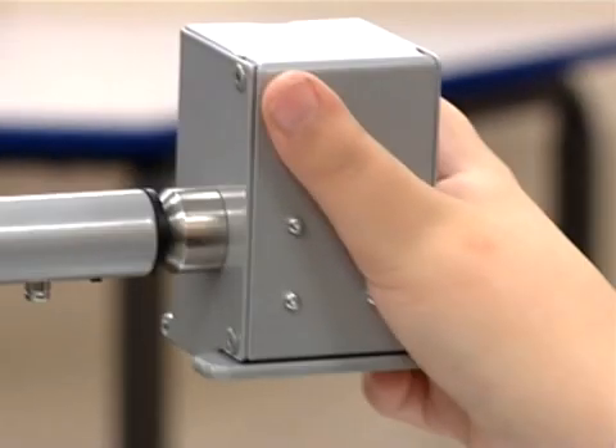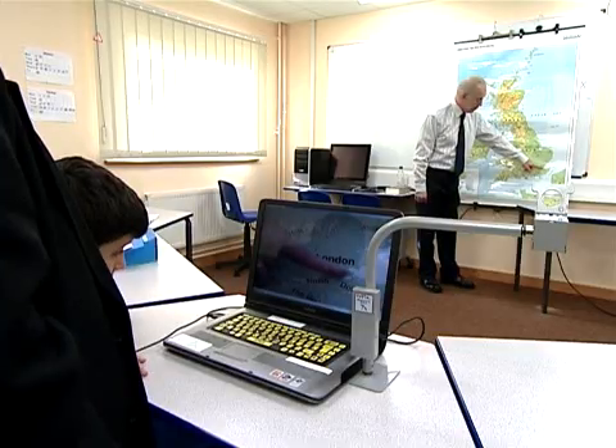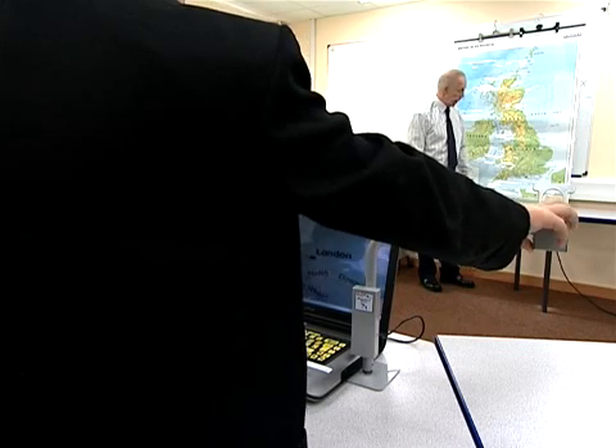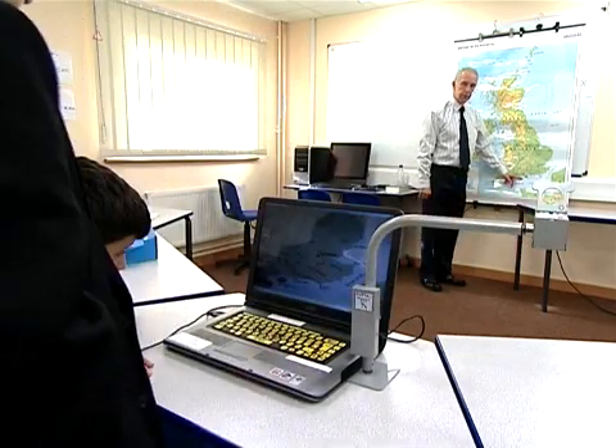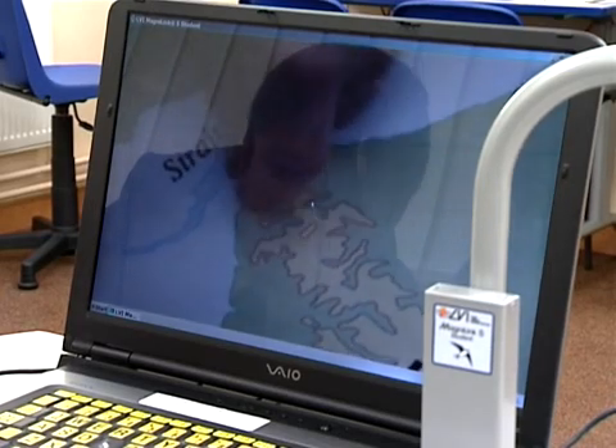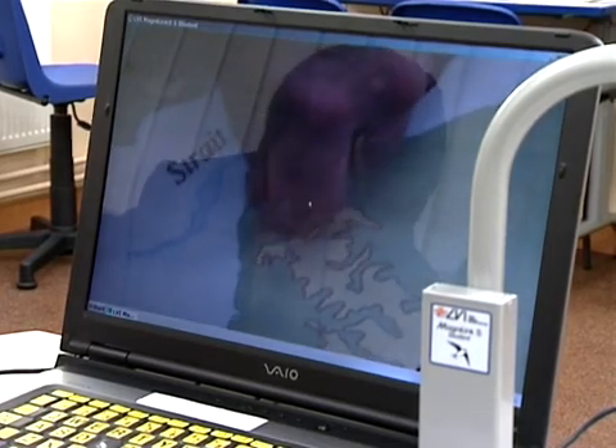One of the most important things, from my point of view, is that the children are included as part of the class. With this little bit of kit, not only can they use it to access diagrams and things in front of them at the back of the classroom, but we can swing it round, flip the lens up, and focus onto the whiteboard — the action that the teacher's doing at the front. They're now part of the class. They haven't got an extra helper telling them things. They can listen carefully to what the teacher's saying and see what the teacher's doing.